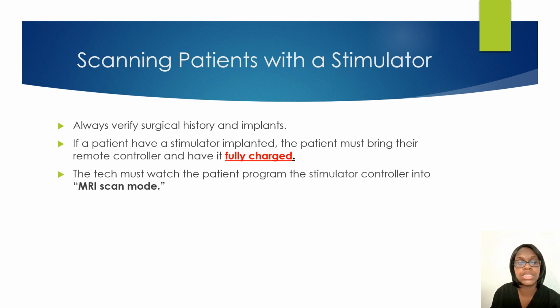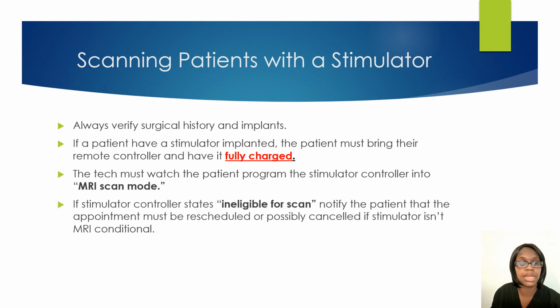And we also had to reach out to the company just to see how long it has been since the patient had that stimulator and if there's something they need to do to get it reprogrammed, or maybe surgically removed and then put back in. So that facility handled that information with the patient.